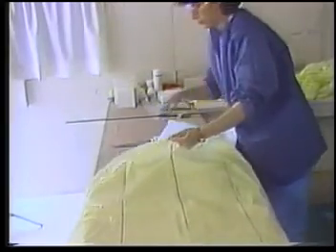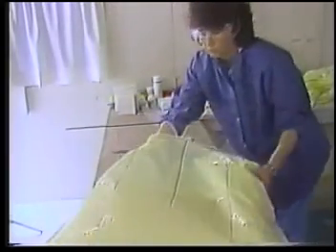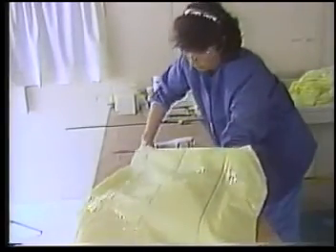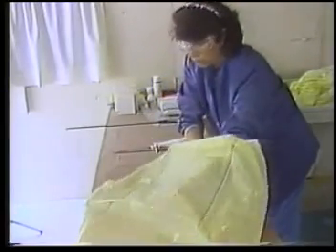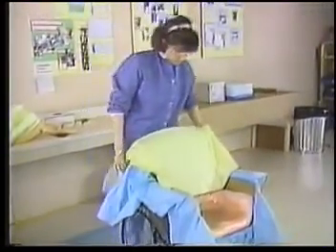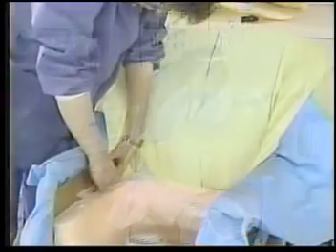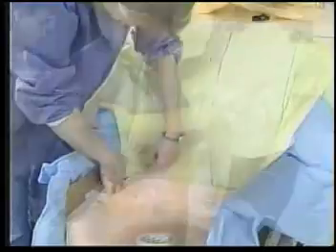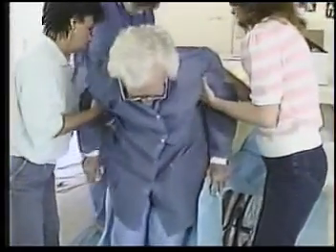Prepare a new molding bag for the back. Place a foam base pad inside of the bag. The thickness of the base foam is determined by the needs of the client. At least 1 to 1.5 inches is necessary. Place the new molding bag containing the base foam against the chair back. Once fitted, tape the ends of the bag in place to match the seat bottom. Reseat the client.